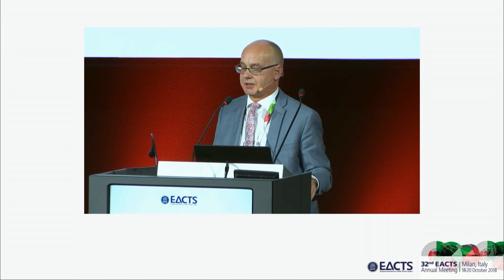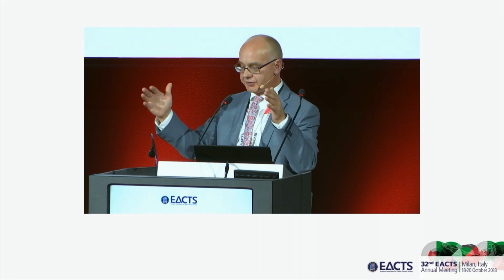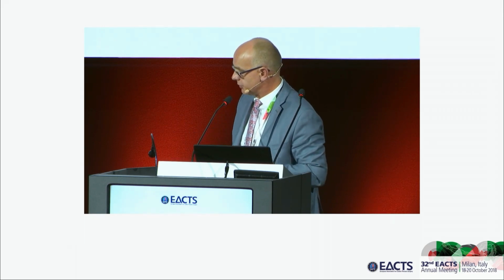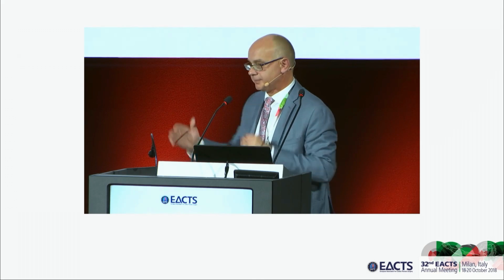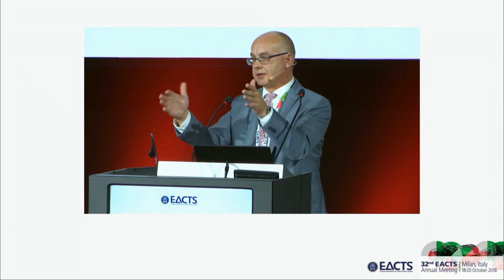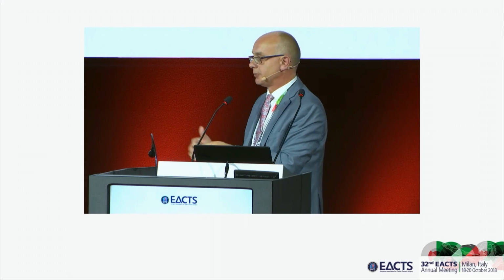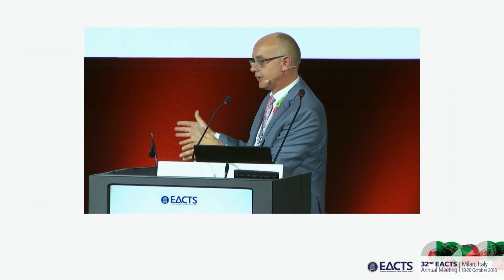The sizing is the same. Basically one needs to realize that in between the ring and the inner diameter of the aorta, of the annulus, is aortic tissue. So it's always the diameter of the prosthesis or the diameter of the ring minus 5. So when you have, let's say, a ring which is 28 millimeters, you will end up with a diameter of the annulus like 23, 22.